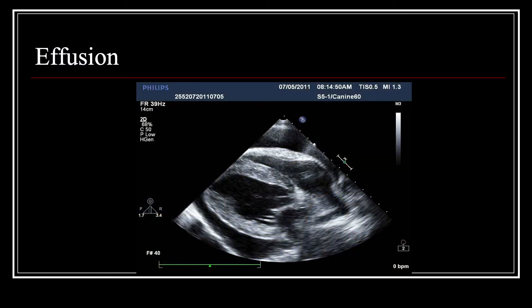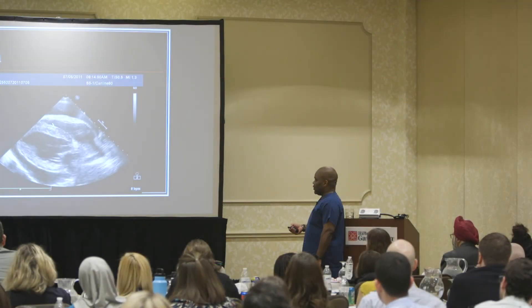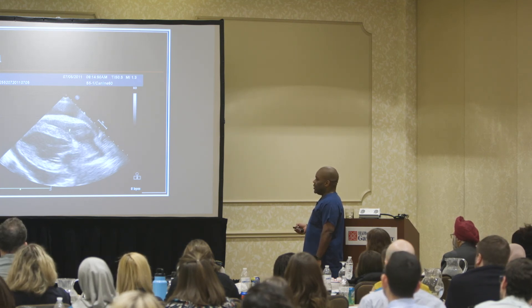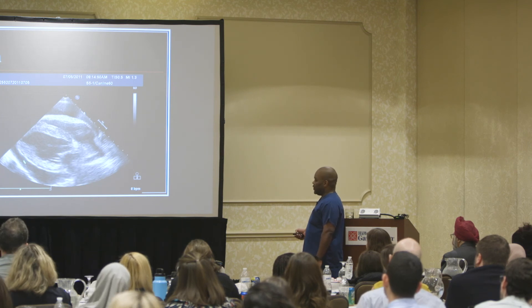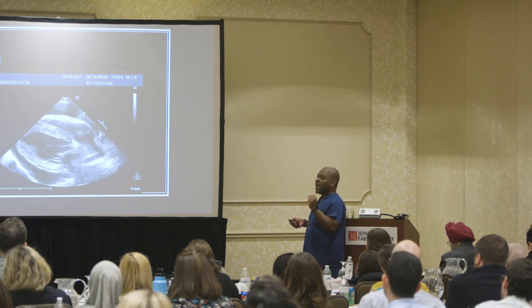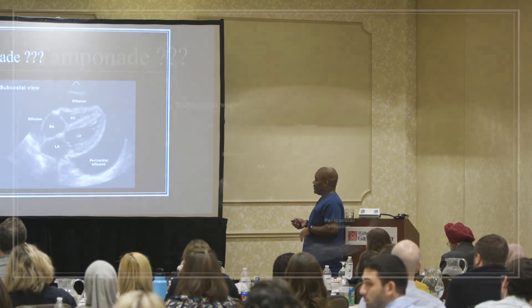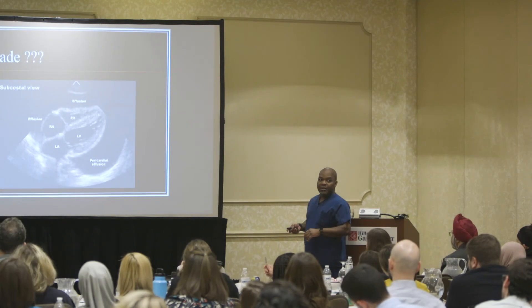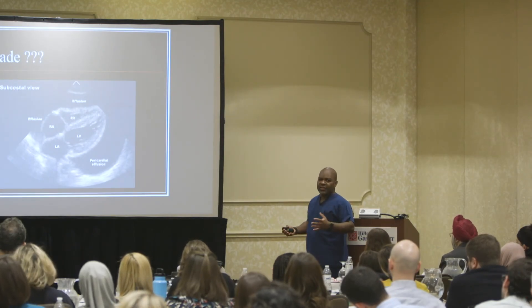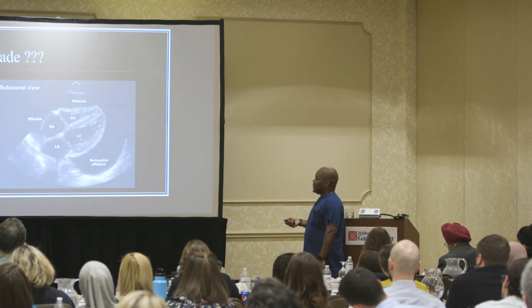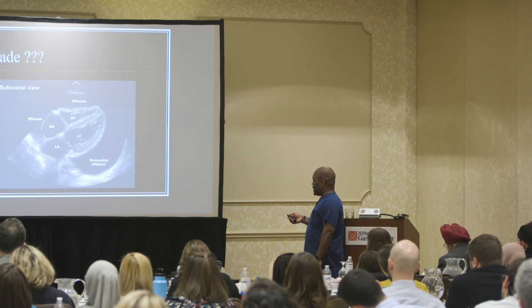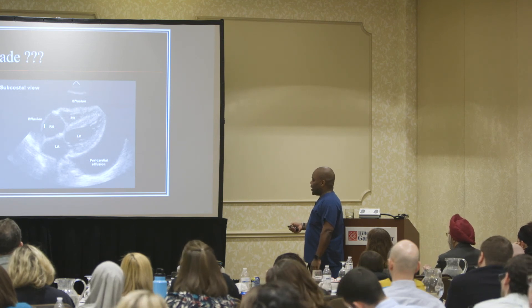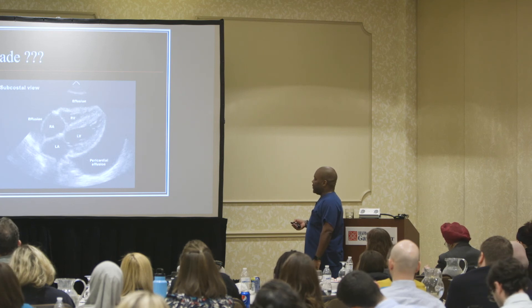Here's a large effusion. Transducer here, right side structures, left side structures. The left ventricular wall is thicker than the right ventricular wall, and there's a large effusion in the sac. You want to call it tamponade — I know you do — but you can't. For tamponade you need the JVD to be going through the roof, the patient to be hypotensive. You can say 'large effusion' but not tamponade without that clinical picture.